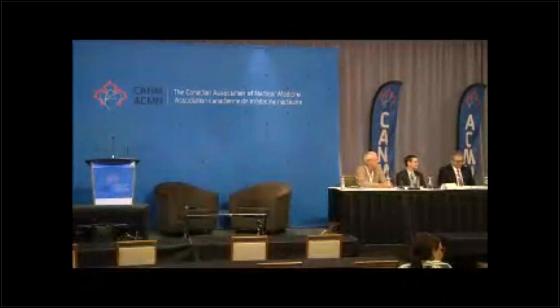And for that late image, do you use gated acquisition? We do gated.